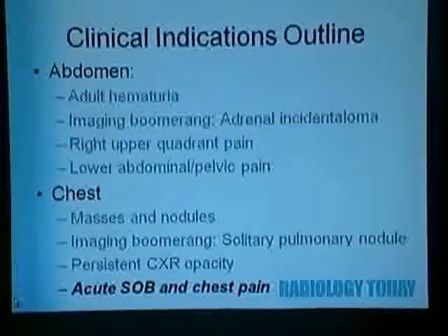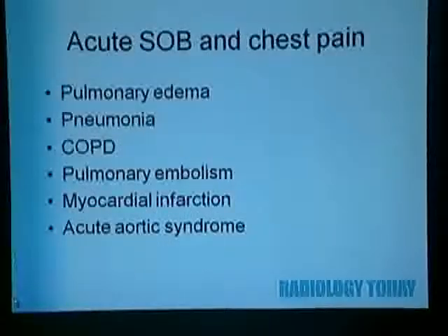Now we'll shift gears a bit and talk a little bit about shortness of breath and chest pain. Now often, there's some diagnoses which don't even require imaging, but there's some that do, and often the first step is a chest x-ray. But sometimes the chest x-ray is negative. In fact, oftentimes it's negative or non-contributory, and the clinician, appropriately so, wants to move on to a CT exam. Well, you should know that we really do use the clinical information provided to us to tailor that CT examination.